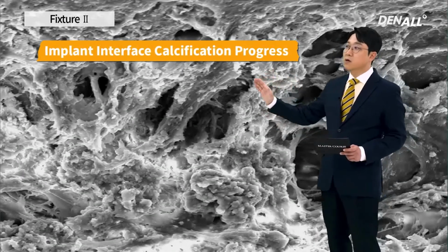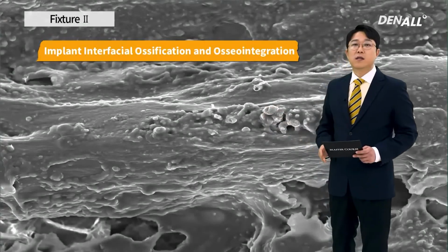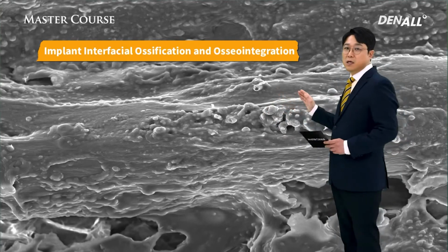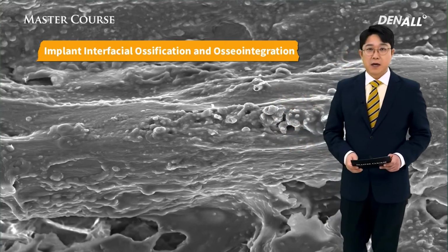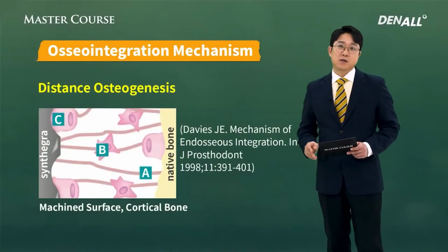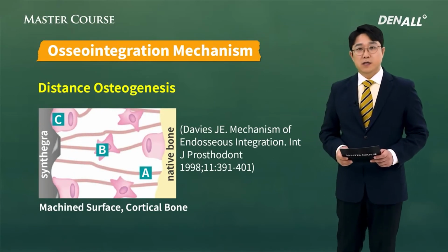The new bone would be ossifying, creating the osseointegration. This process is the process of osseointegration, creating the secondary stability.